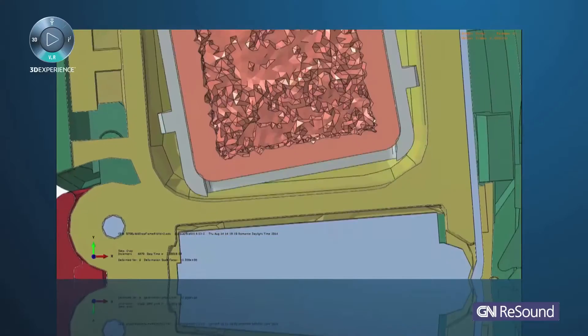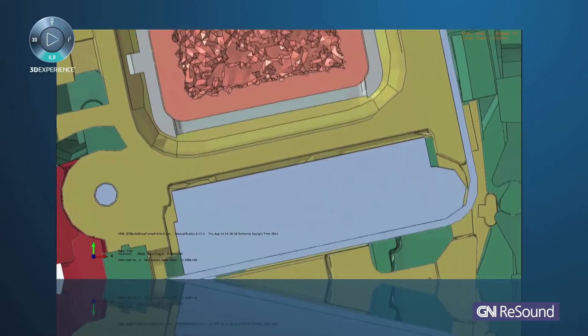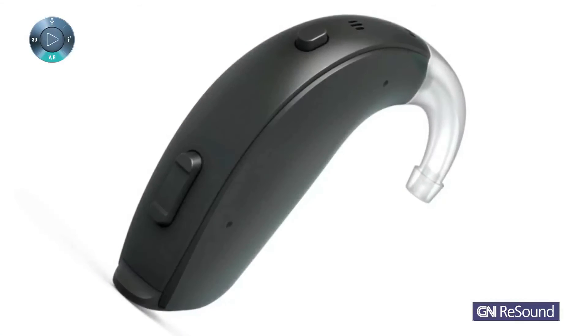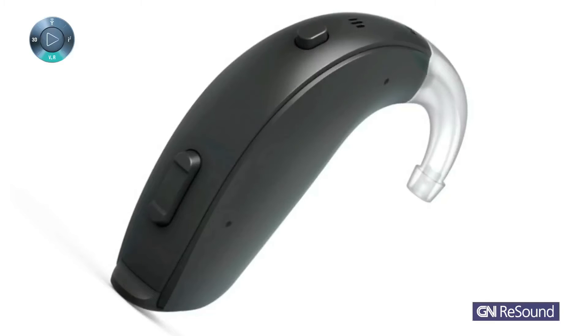The most interesting part with Abacus Explicit was when we saw the first animation of the drop impact of the hearing aid — we actually got some ideas right away because we could understand how it was absorbing the impact. At that point, with just the first animation, we already had new ideas for the next design we would try to simulate.